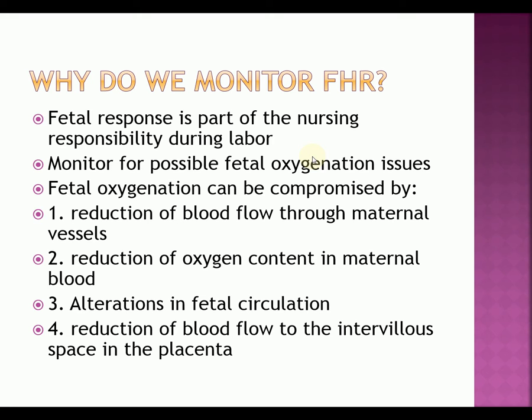So making sure that we see how the fetus is responding to labor is a big thing, especially if we are having complications. We want to make sure that our fetus is responding well and still has oxygenation. So these are some of the things that we look for.